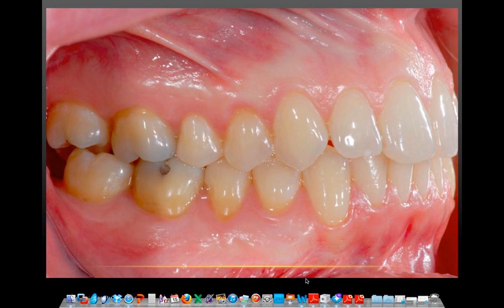Here's what we want it to look like. Not bad, right? Second molar is visible, pretty dry, a little bit of moisture. I'd take some points off of my shot for this. There's a bubble there. Soft tissues equal above and below. Occlusal planes down the middle. I can see all my teeth. I wouldn't call this an A, but maybe an A minus, strong B plus. Again, that's how I grade myself. But if you were a first-year dental student doing this, maybe I wouldn't grade an A, a B minus or B plus. Maybe I'd give this an A because I think it's a stellar effort for somebody just getting started.